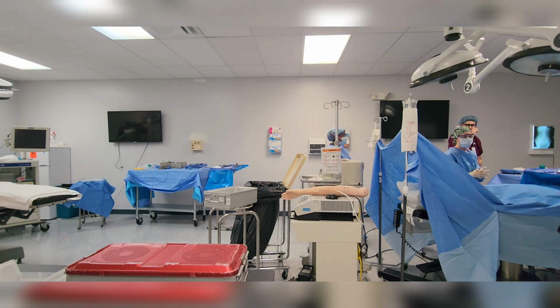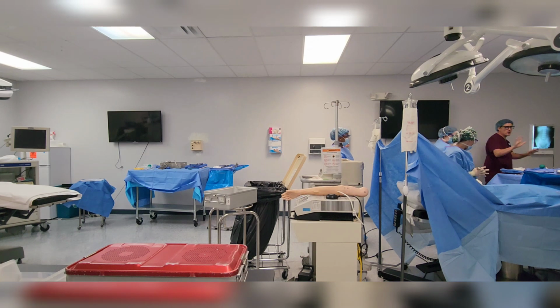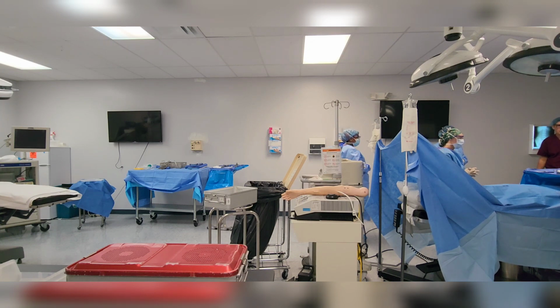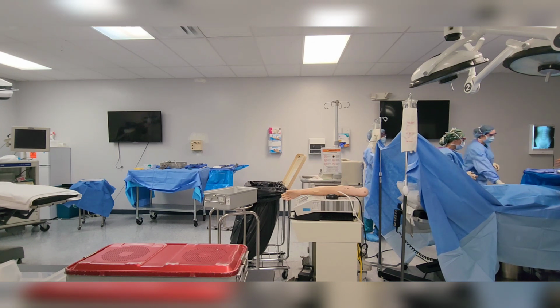So with that, go ahead. I'm just curious about the reason why. I'm just going to show you why, because I was taught too. Okay, so the reason why is I usually put it right here. I have everything there. What we were taught was if you have the L, especially as students, their back is to the field too close, and they're running into the field. That's what we noticed when we had students when I was precepting students. So when we taught it like this, you stand right here. You have all your stuff. That goes on the side over there, because remember, all that stuff's going to be coming up. Gotcha. So literally, you're standing right here, and everything is literally right at your fingertips.